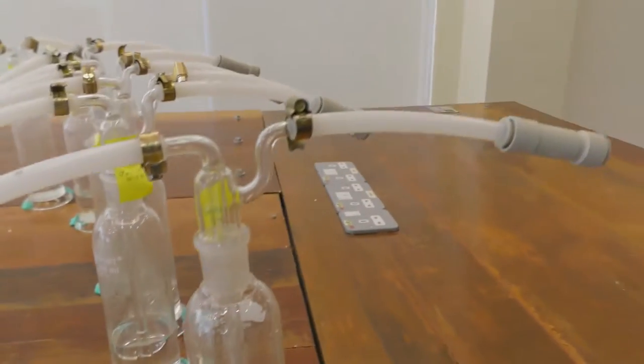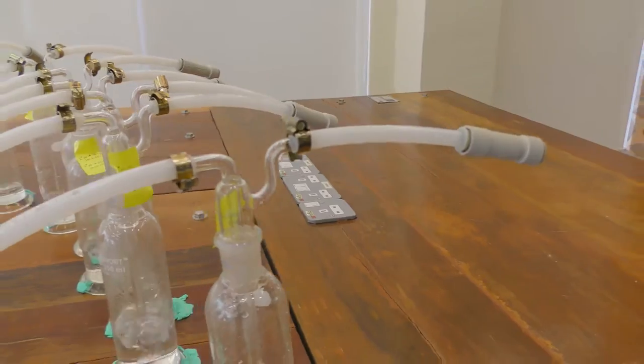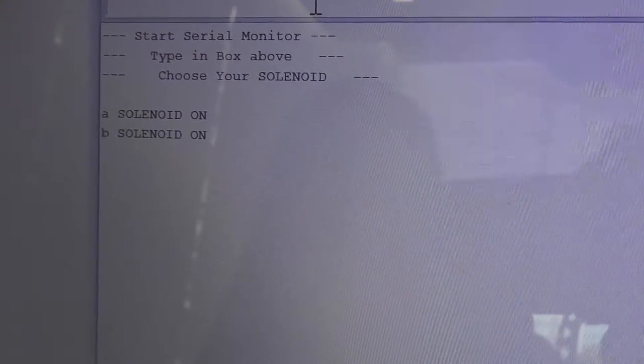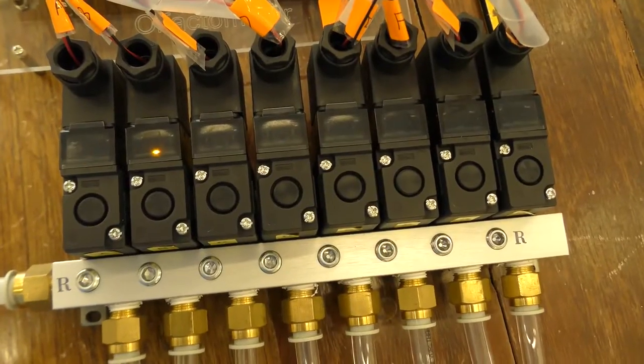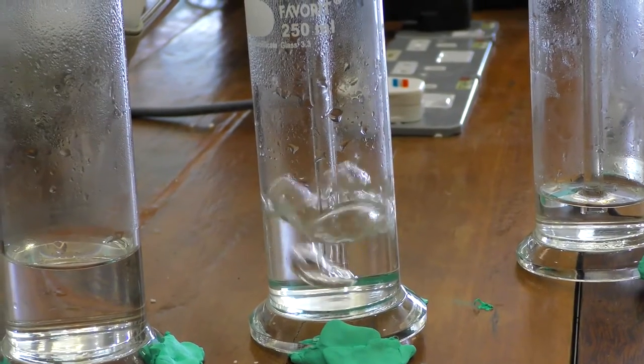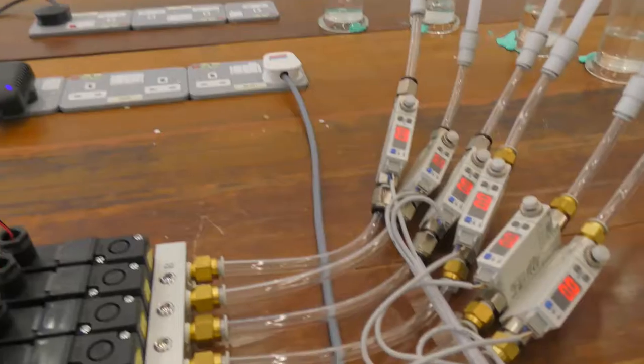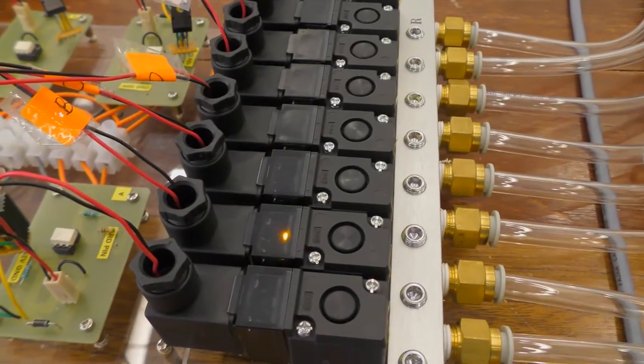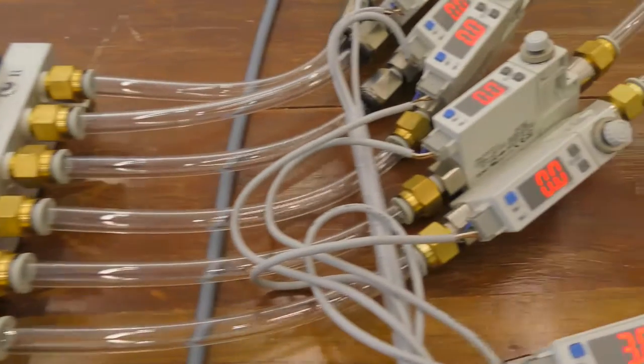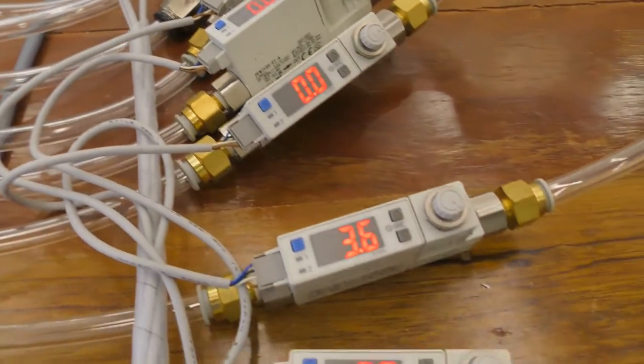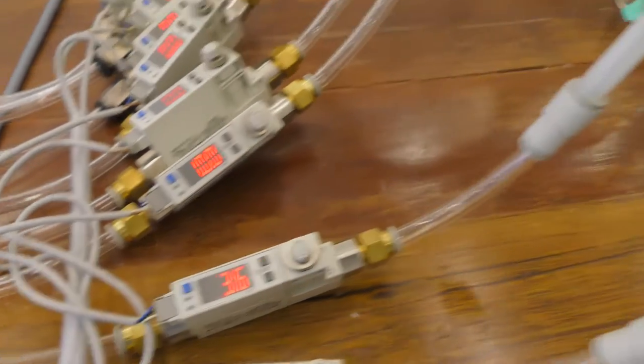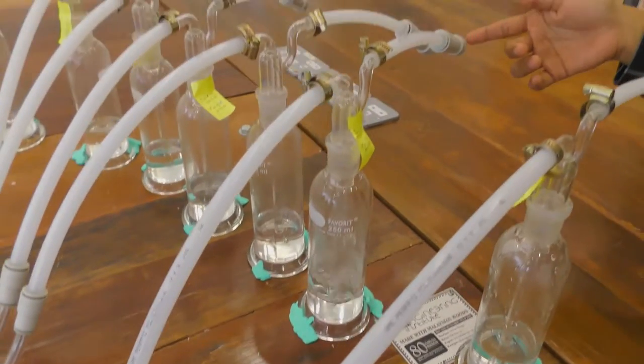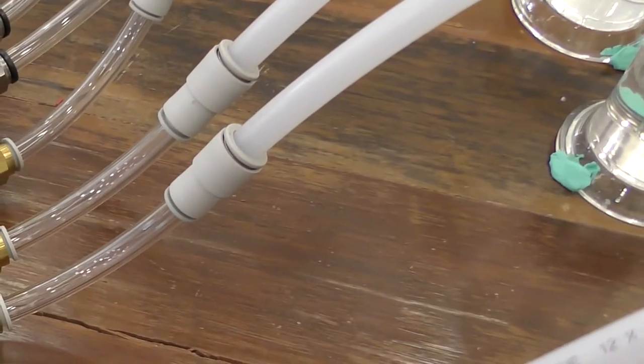If we change to the character B, valve A will switch off and valve B will switch on. At this point, the flow rate is 3.6 liters per minute and the user can smell at the glass tube. This is the process of the olfactometer system.